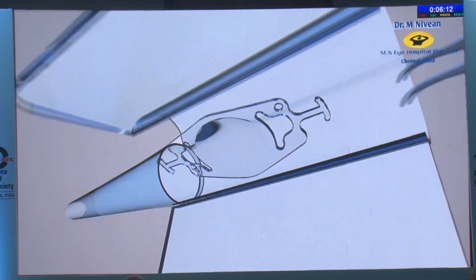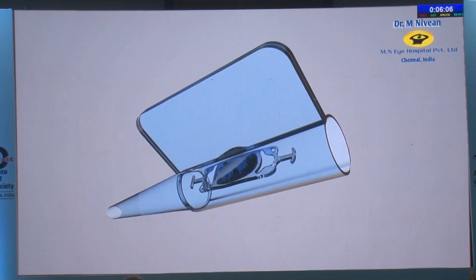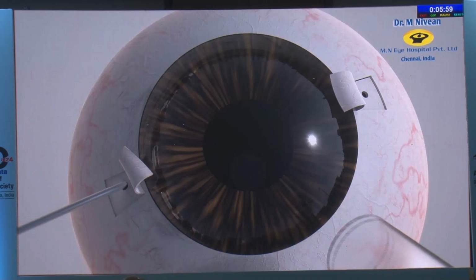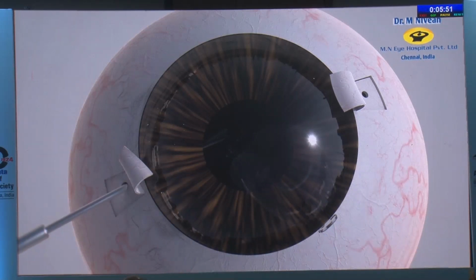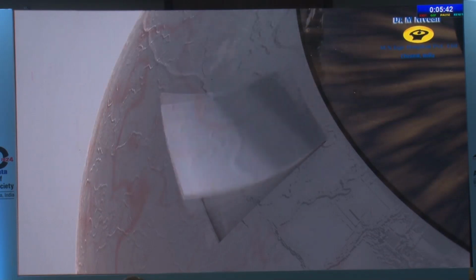This is a short animation of how a T-Flex IOL is loaded into a cartridge, and as you can see, it is loaded in such a way that the T haptics are the first to emerge out from the preloaded syringe. The leading haptic of the T-Flex IOL is gently grasped by the Pranav forceps and is brought out of the same sclerostomy site. So with the help of it, you bring it out and it sits in nicely.